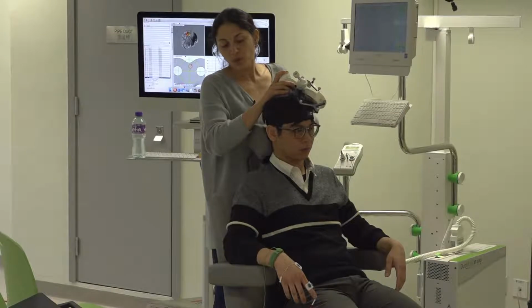So you see that both fingers are moving.